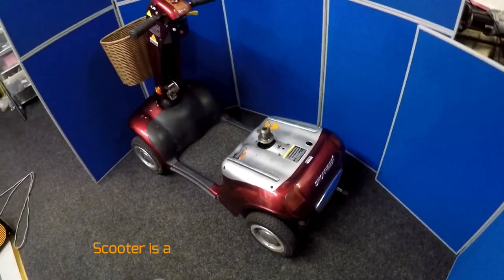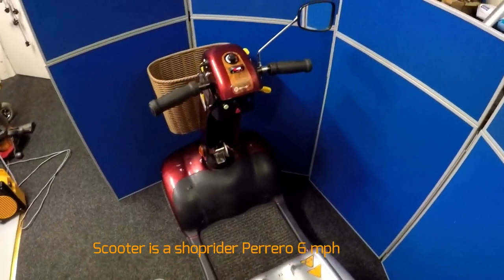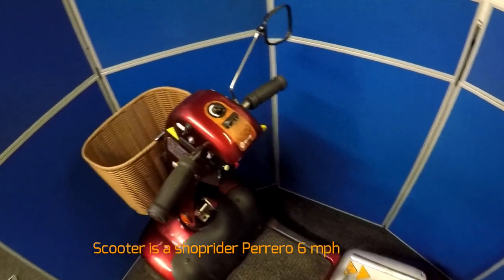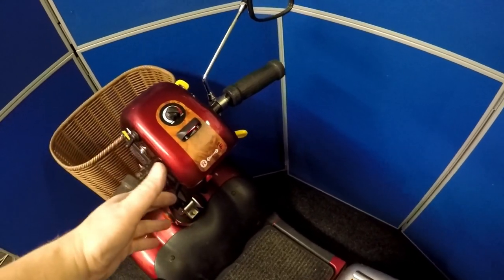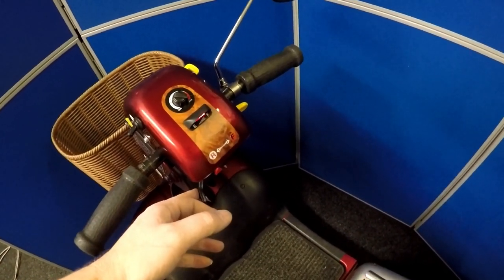Today I'm working on a Shoprider 6mph scooter. This scooter has just come in — the customer stated that it's become very jerky. One minute it will go, one minute it won't. When she presses the lever to go forward, nothing happens and suddenly it takes off like a rocket. So I've got it in freewheel.